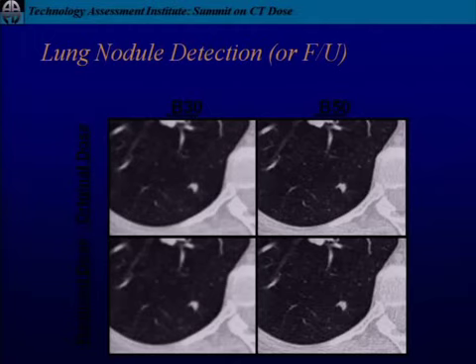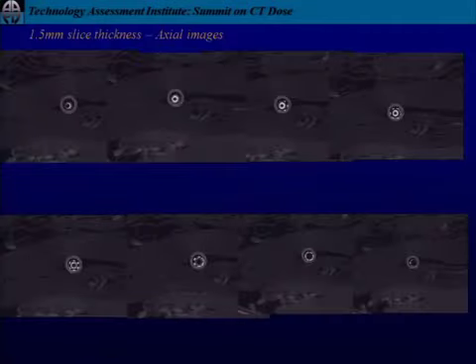Lower dose, a little smoother, okay? Or if, heaven forbid, somebody had done this acquisition the first time and reconstructed it this way the second time, right? So you want to keep it consistent, especially when you're trying to do comparisons. But my point here was, in certain applications, you can go way down in the techniques, right? We're going to hear more about that later today.